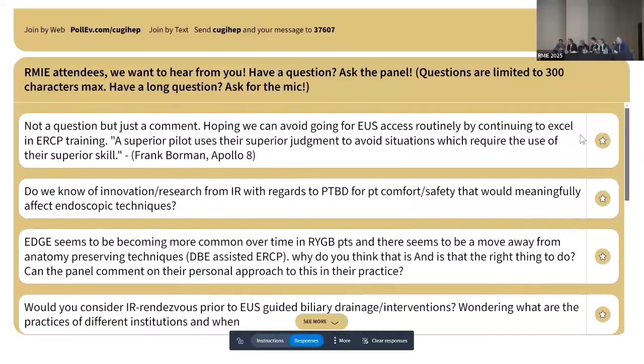It's a great question. I would say it's both. The size of the forceps matters a great deal. That's why pediatric forceps, even without targeting, can often give you a diagnosis. At the same time, for the biopsy here, and especially for all of us, we're all novices in the field, so for all of us to say this is the highest risk point is also important. And then better technology to help no matter what. You watch these beautiful videos of the forceps getting every side of the bile duct. It's very difficult to do that in real practice. So if there are better forceps that can help us target the area that we now know is abnormal, that would also be a game changer. So I think it's all of those things. Yeah, I 100% agree.